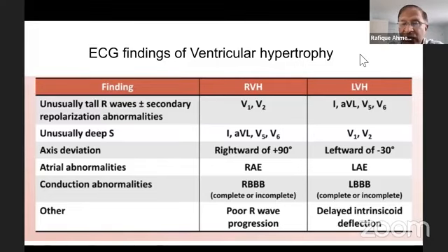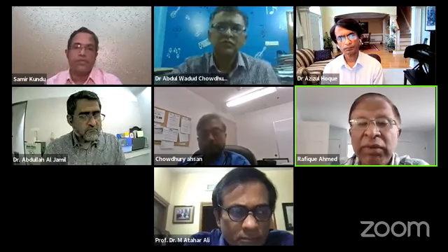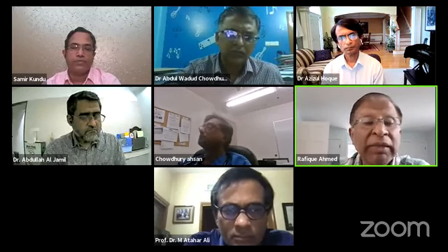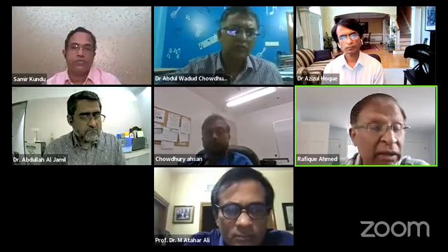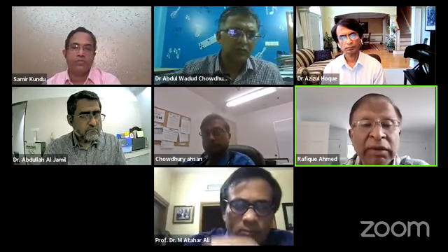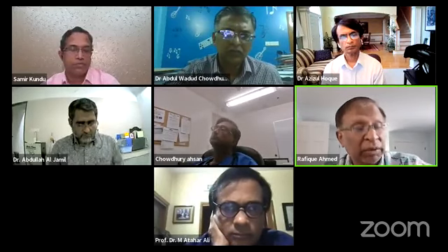We have to be careful about over-interpreting something. Wadud mentioned that if you are in an Upazila health complex and you think somebody has LVH, you can make an assumption that maybe there is diastolic dysfunction. This is the good old clinical medicine that our professors used to practice. They didn't have any investigation, nothing. But we at least have the ECG available.